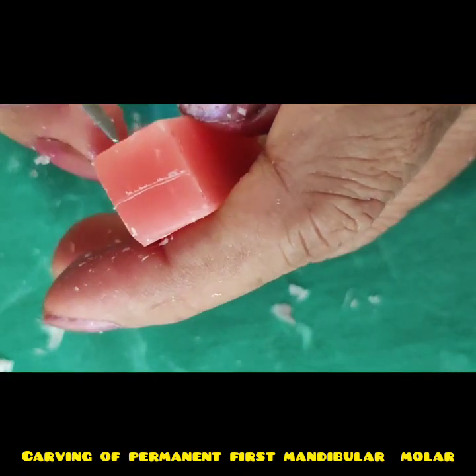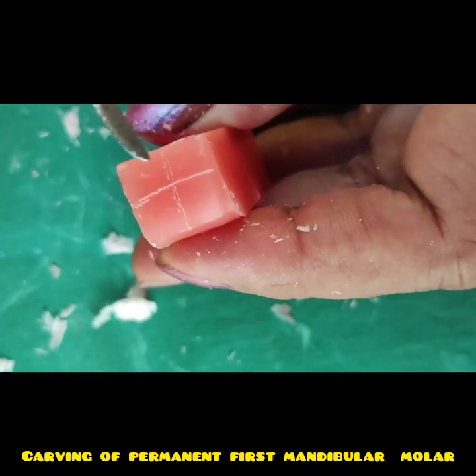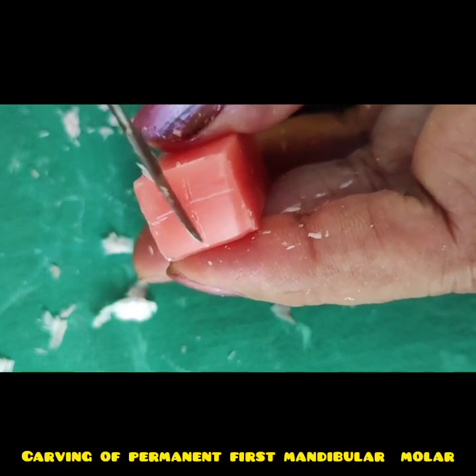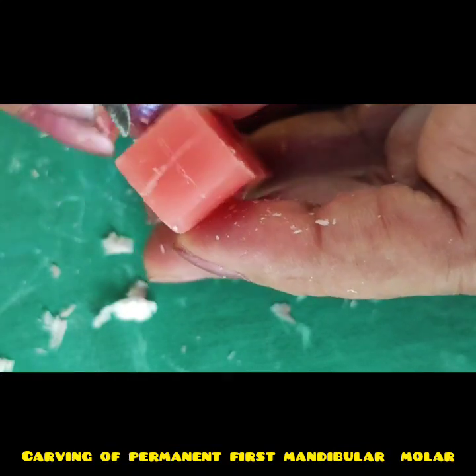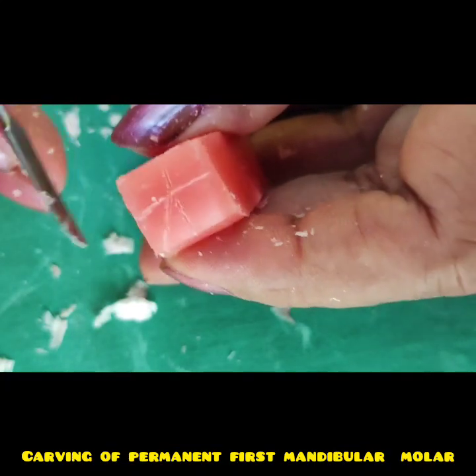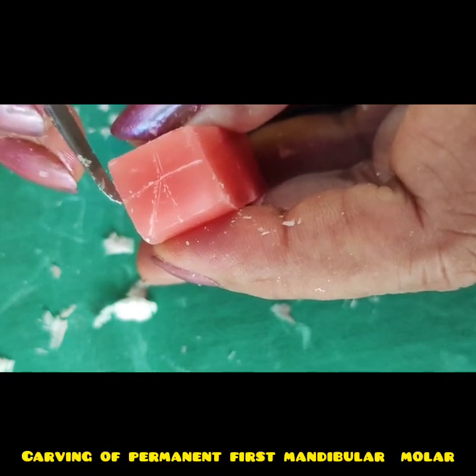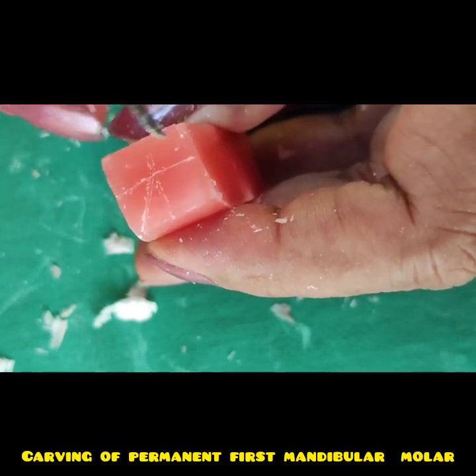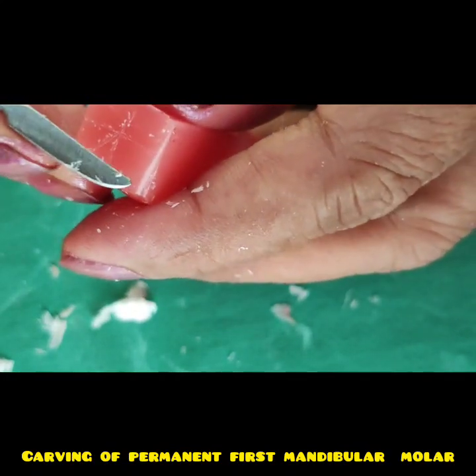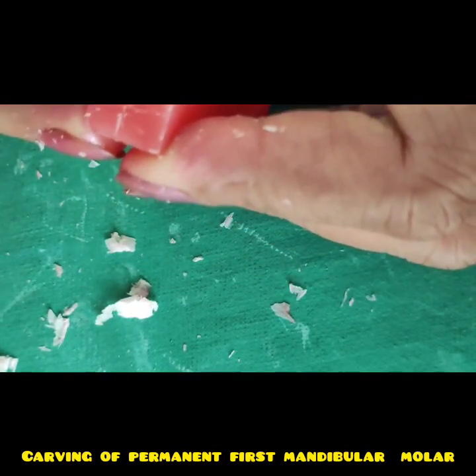Divide the occlusal surface into a plus sign. There are five cusps total on the occlusal. The first, mesiobuccal cusp, occupies this quadrant completely, and the second quadrant divides into two halves diagonally. The second cusp will fit in this quadrant, the third cusp will fit in this quadrant, and the marginal ridge will fit here. Mesiolingual will fit here and distolingual will fit here. So utilize the first quadrant for the mesiobuccal cusp, utilize the entire quadrant.